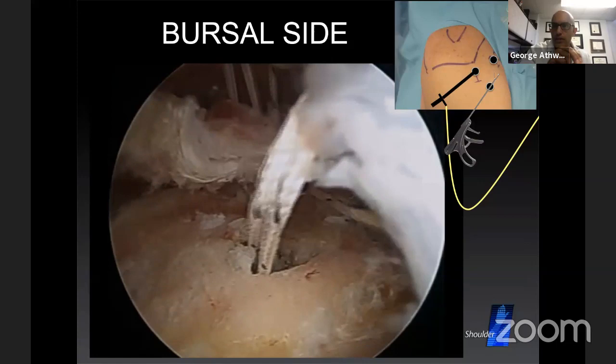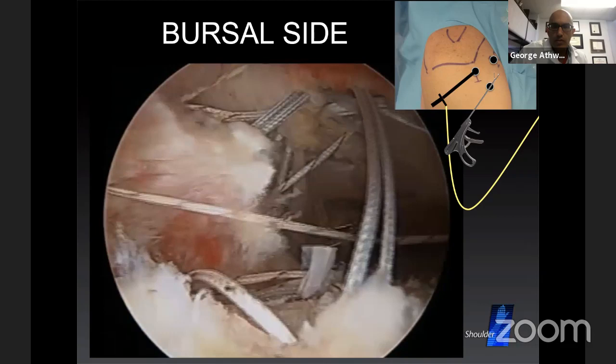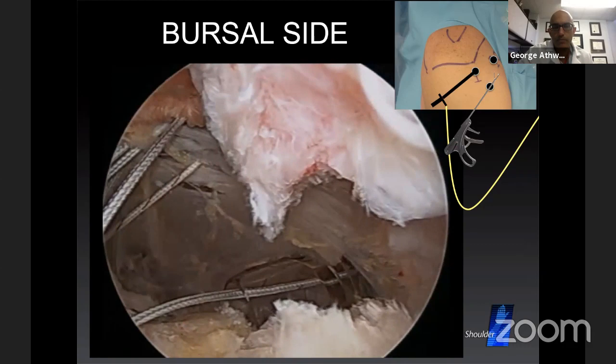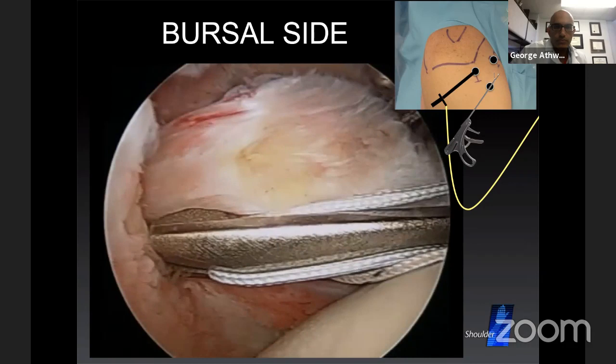as I come in with my antegrade passer. So here we are, we're going to come in again, pick up the stitch, pick up the next stitch on the way out. There we go, bring it back out, load that up. And then once I've loaded that up, I'm going to come back in. And now that I've passed a bunch of the inferior sutures, the tendon stays relatively reduced. It's not retracted as far. Come back in with my antegrade passer. Have my assistant ready to grab the stitch. Pass the stitch.